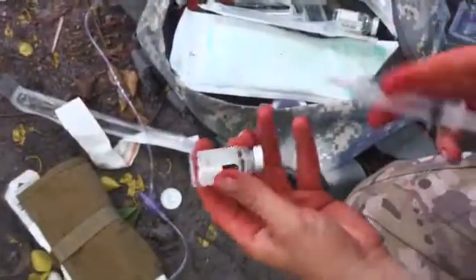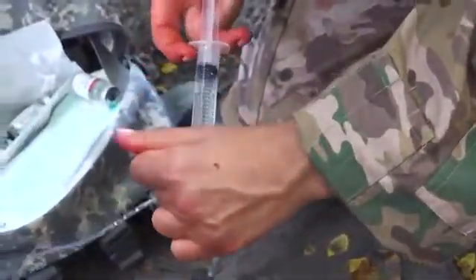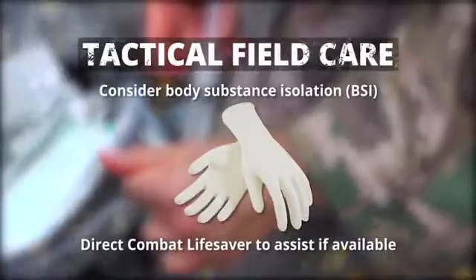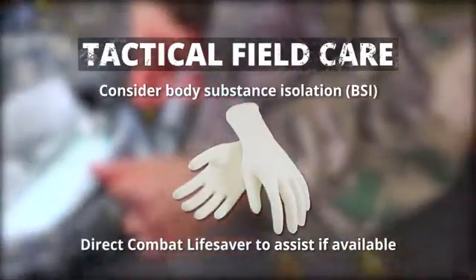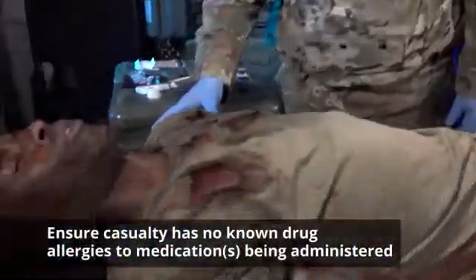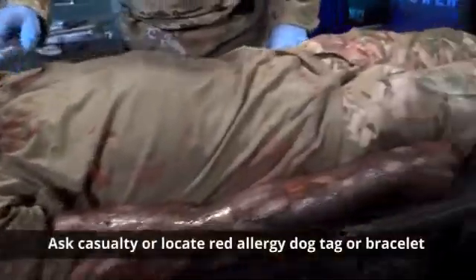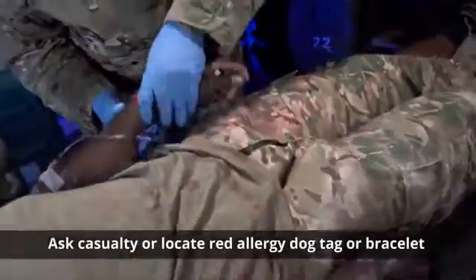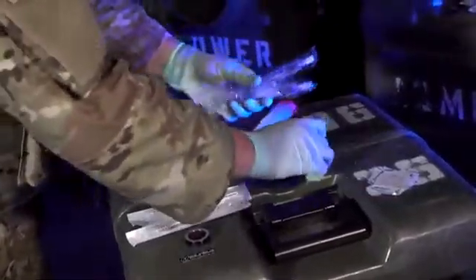This is done in the tactical field care phase when a casualty with established IV access requires the administration of IV medications. Consider body substance isolation. If a combat lifesaver is available, direct them to assist. Check to ensure that the casualty has no known drug allergies to the medications being administered. Ask the casualty or locate their red allergy dog tag or bracelet. Gather all needed supplies and necessary medications.